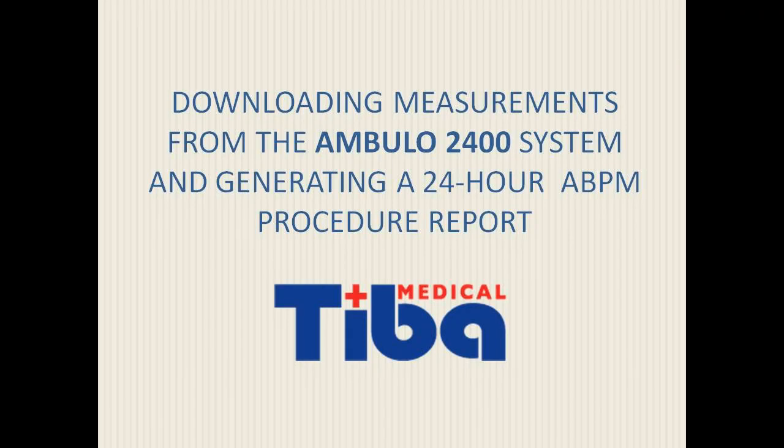This video will take you through the steps of downloading data from the Ambulo 2400 device and printing reports.